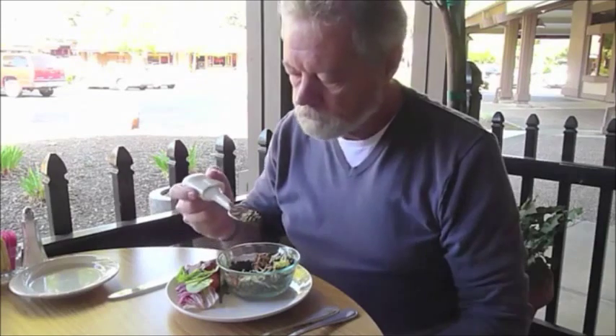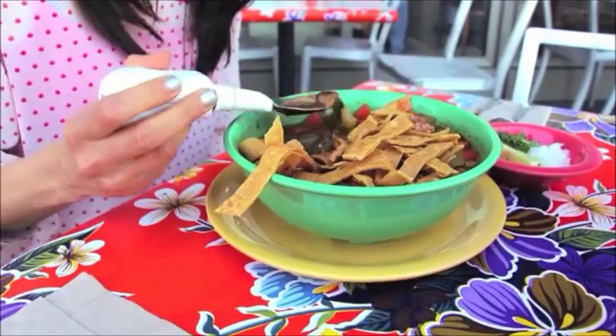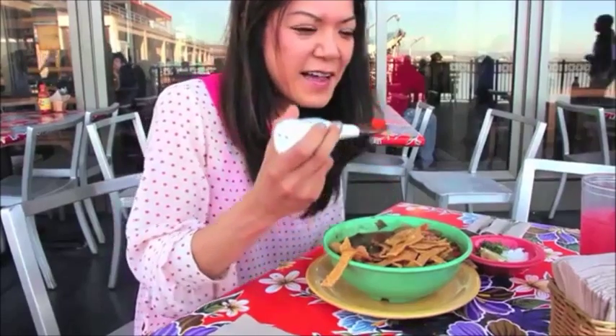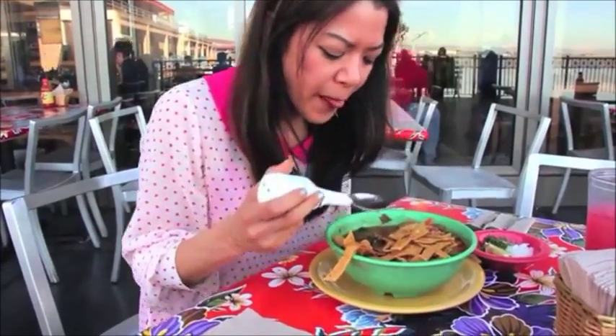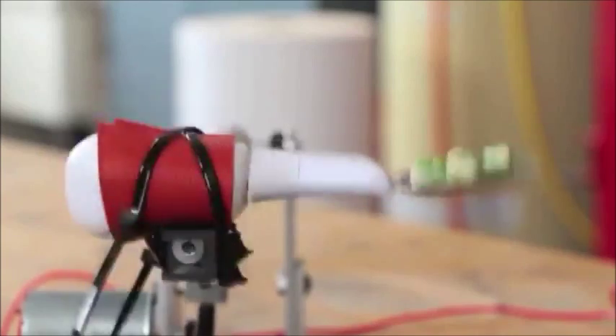Originally, Pathak was working as a doctoral student at the University of Michigan to design technology to reduce casualties for U.S. soldiers fighting in Iraq. Normally, this would have nothing to do with the invention of something that would help someone with shaking hands. However, in this case, Pathak's experience in this field started him off to create an idea and ultimately selling the product called the Smart Spoon.